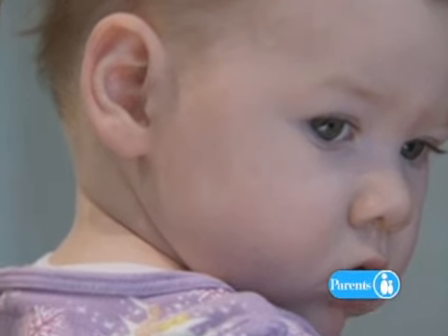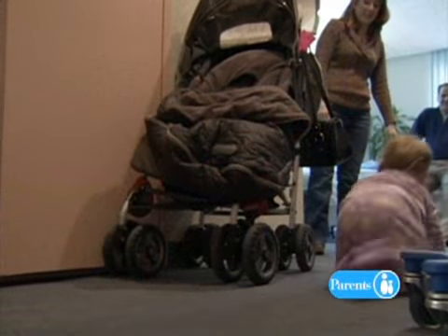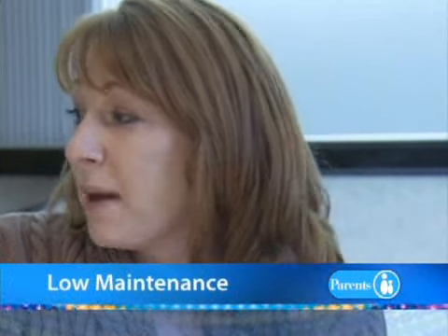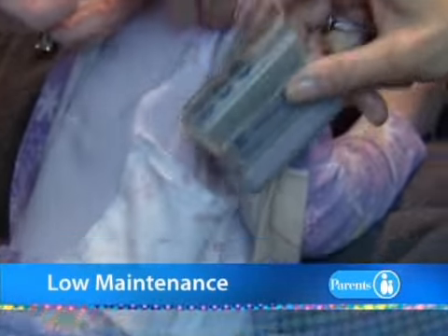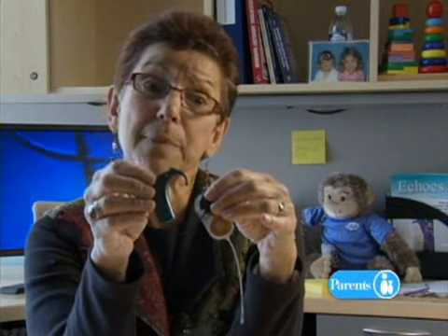It's pretty easy. She does not try to take it off at all. It's held magnetically on. There's a magnet inside the internal piece, and the external piece has a magnet. She has the microphone on here. And the maintenance, the batteries are rechargeable. It's a body-worn processor at this age because the behind-the-ear units are very heavy, too bulky for the babies to wear. As far as these kids are concerned, it sounds like it sounds to you and me. Now, the people who've had hearing losses, who had normal hearing and then lost hearing as they got older, say it doesn't sound exactly like it sounded in the old days, but it sounds well enough so they can understand speech, they can talk on the telephone, and they can live their lives hearing.